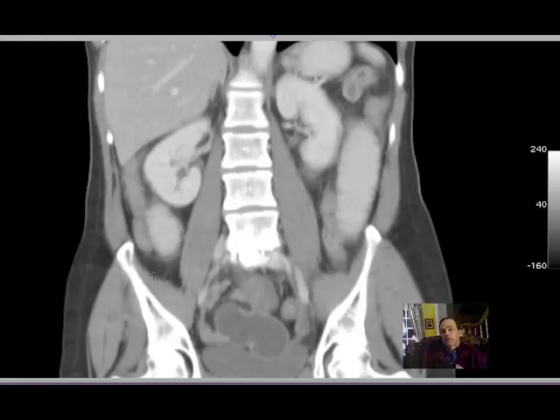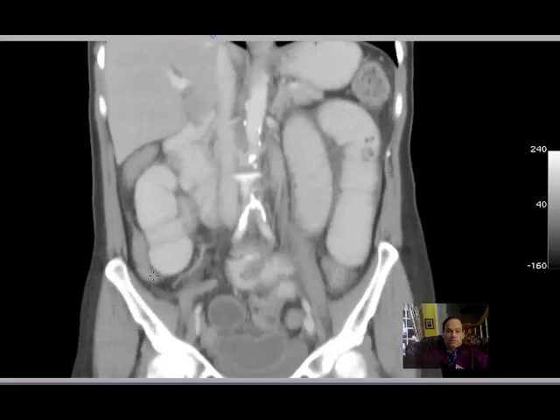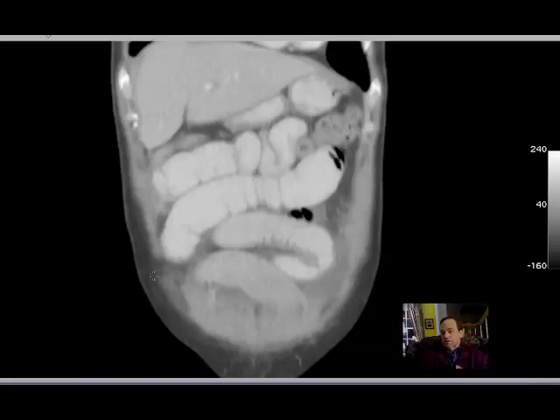So it's a common problem, and we look at it often, and it is very useful to have someone whose eyes are open to this possibility, who will look and say, I think there's a small bowel obstruction here, because it's nice for a radiologist to grab that case next instead of just a chest x-ray.